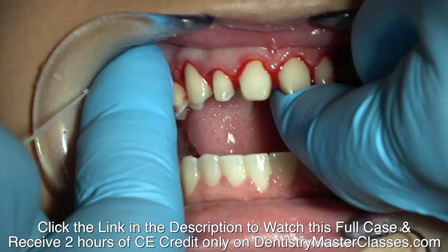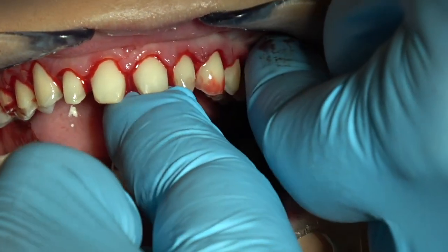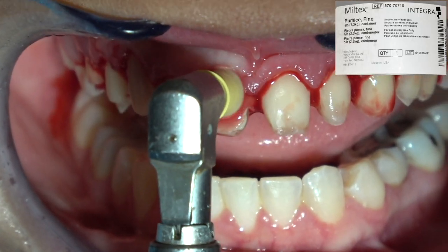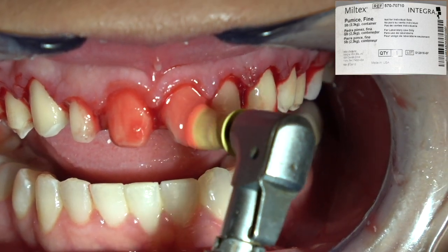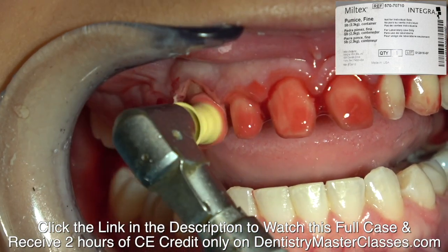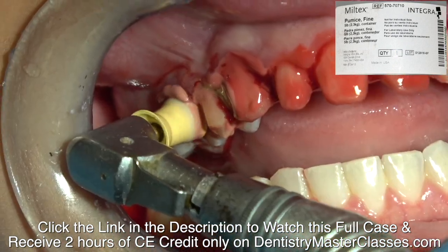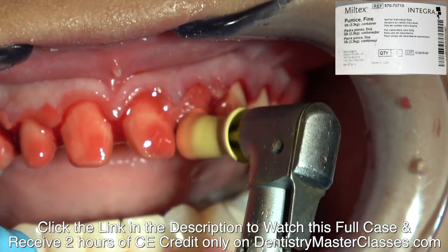She hadn't been able to floss them and her home care wasn't the greatest, and she's had periodontal crown lengthening surgery 10 weeks before this. So don't worry about the bleeding right now — you're going to pumice the teeth with pumice and water in a profi cup and just get rid of any little bits of debris on the teeth.